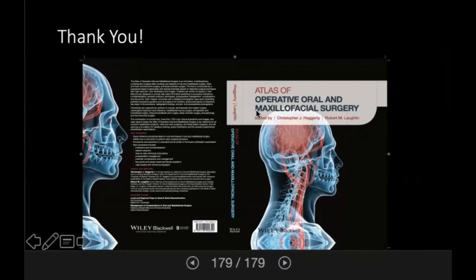Dr. Yassin had also mentioned that there are certain tools. I don't like to necessarily talk about products, but there is one called Versah. They use an osseodensification system where they actually drill the burr in reverse, and that really thickens the area and performs your osseodensification. So there are multiple things you can do. Yes, they are advised if you get into posterior maxillary bone that's very soft, or if you know it ahead of time by looking at the Hounsfield units on your CT scan.